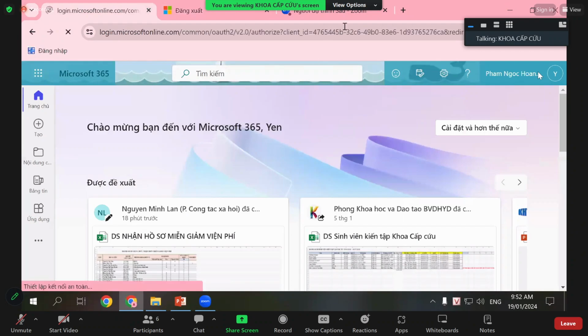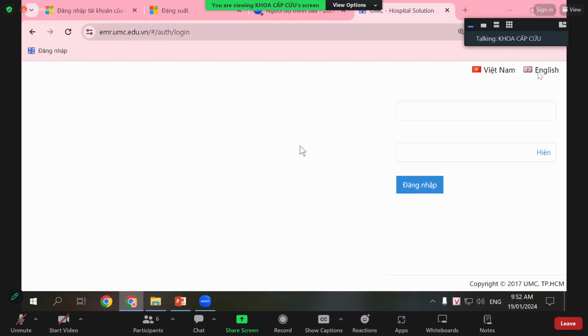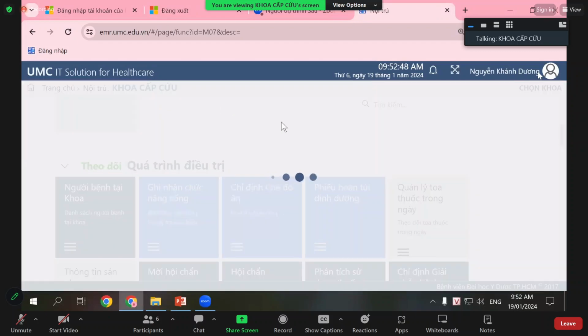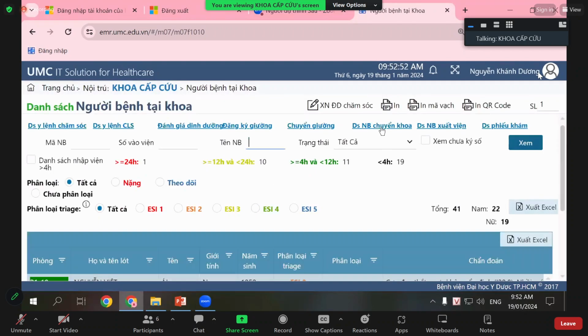That would be my thought too, heart failure, or myocarditis, because you can see pregnancy-associated cases. But when we used ultrasound, we saw the root of the aorta was a little bit larger. Dilated? Yes, dilated.